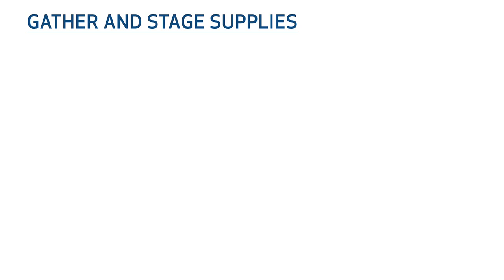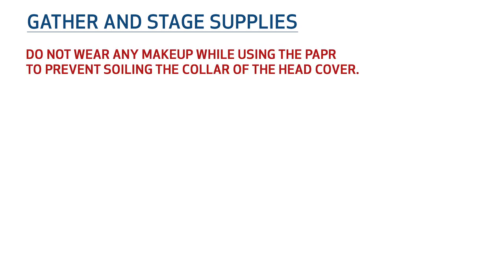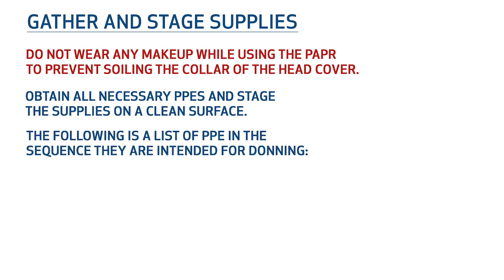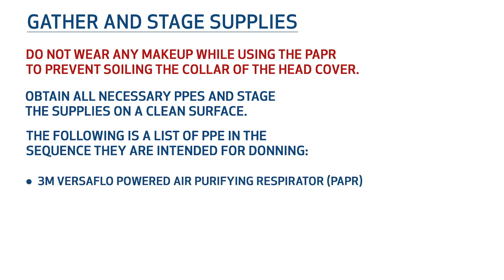Gather and stage supplies. Do not wear any makeup while using the PAPR to prevent soiling the collar of the head cover. Obtain all necessary PPE and stage the supplies on a clean surface. The following is a list of the PPE in the sequence intended for donning: 3M Versiflow Powered Air Purifying Respirator or PAPR, surgical gown, gloves, and disinfectant wipes.